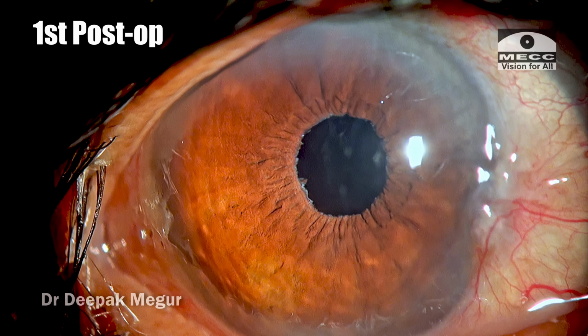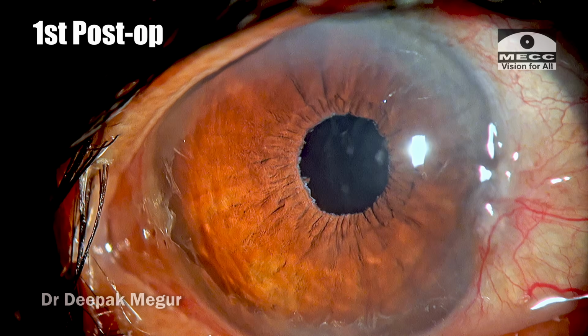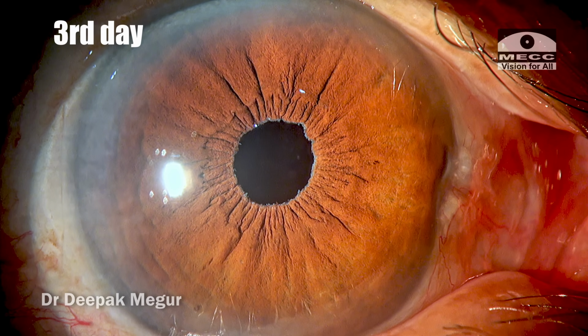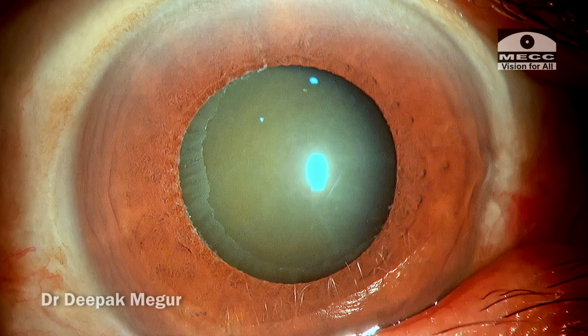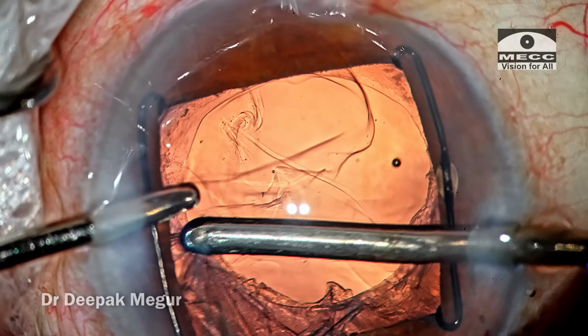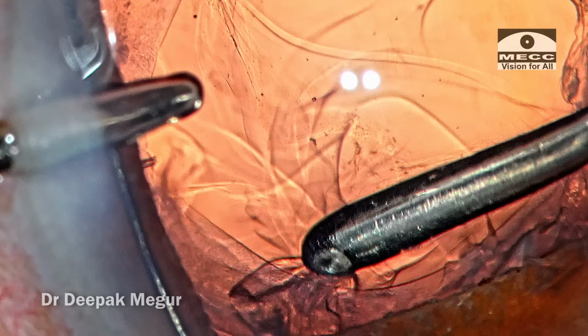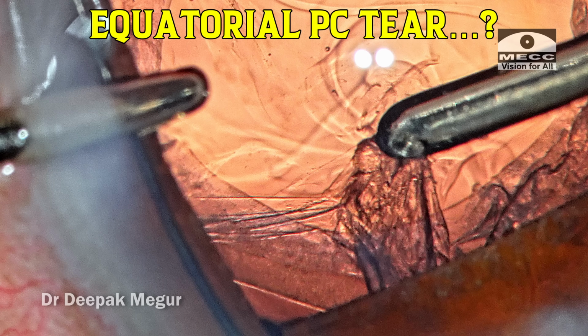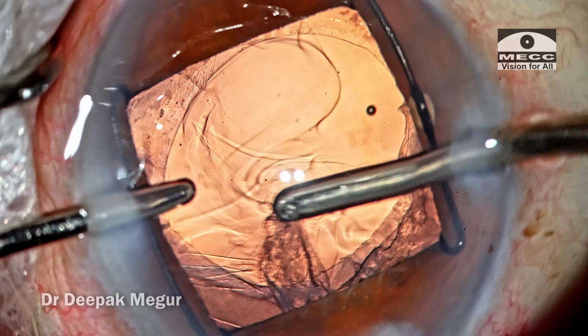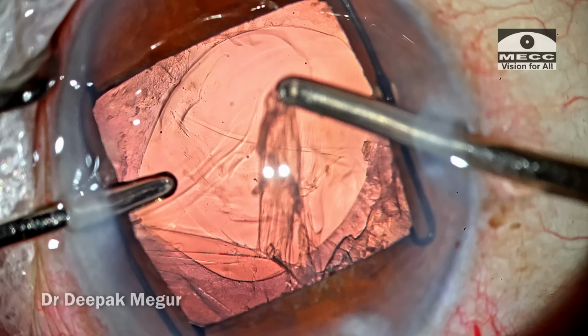These are the first day post-op pictures. There's minimal corneal edema, and these are the third day post-op pictures. The edema is decreased and the patient is doing well. So this was another case with pseudoexfoliation, loose zonules, and a very tricky appearance of the posterior capsule which confused me, and I had to take a moment to analyze and differentiate an equatorial posterior capsule tear from zonular weakness, because the way of management is totally different.